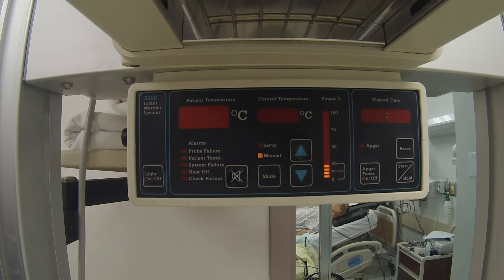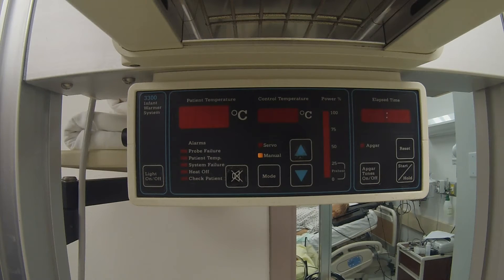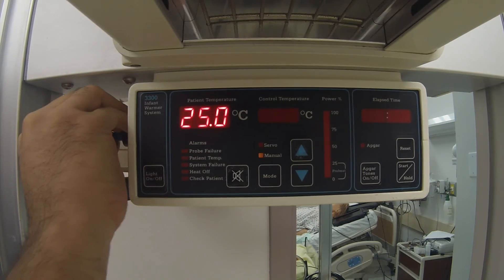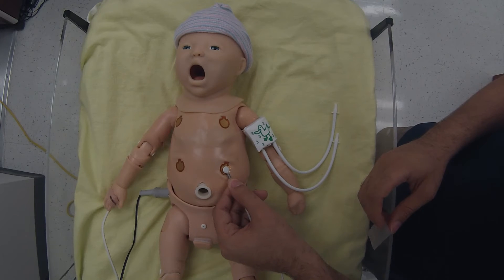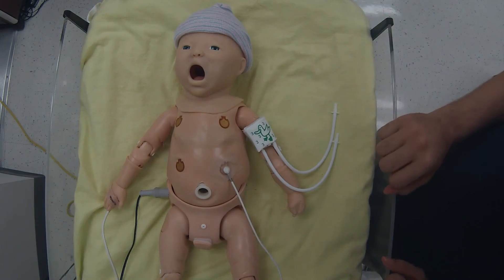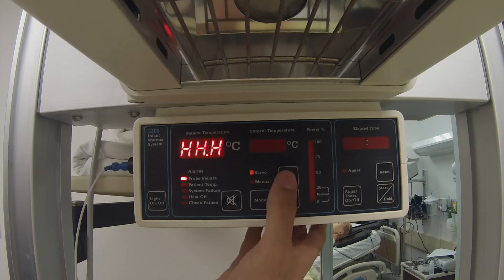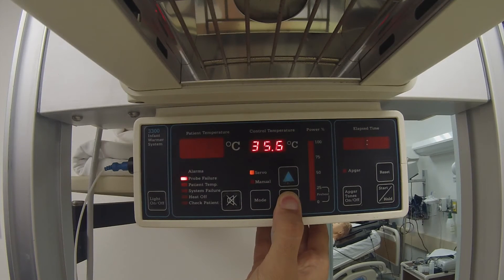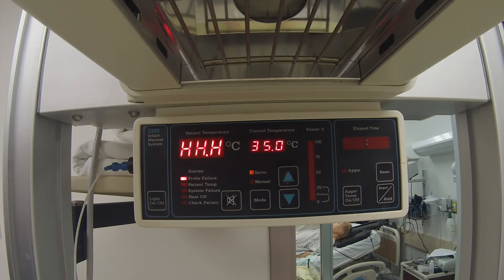If long-term monitoring is needed, the IWS has a servo mode that uses a temperature probe to self-regulate the unit's heat output. Insert the jack end of the temperature probe into the unit via the input jack located on the left side of the control module as viewed from the front. Attach the patient end of the probe to the abdominal area of the patient, placing the metal side down. Next, attach the probe with a heat-reflecting foil surface away from the patient. Press the mode switch to change from manual mode to servo mode. The indicator light will illuminate, indicating that the unit is in the servo setting. Once the desired patient temperature is set, the probe will regulate the power of the unit up or down to keep the patient within 1 degree of the patient temperature setting.